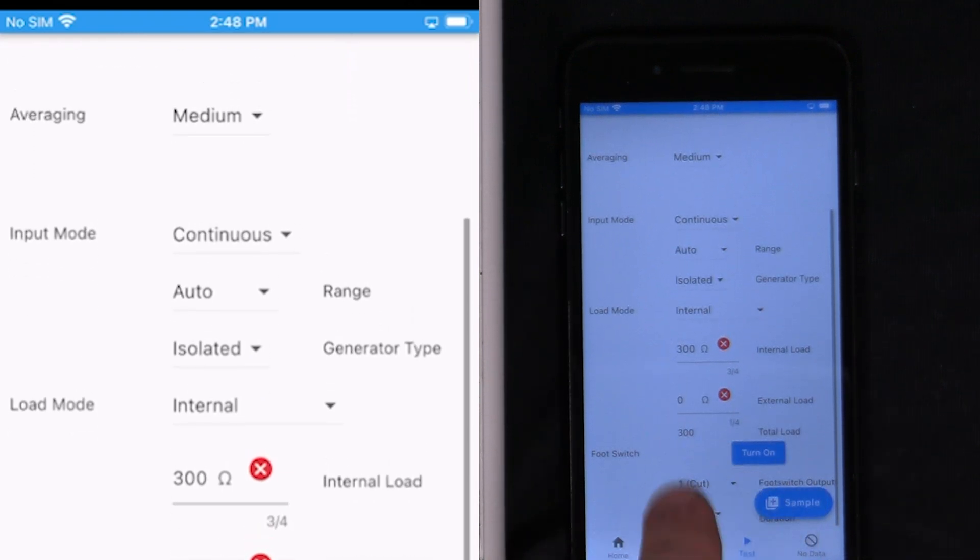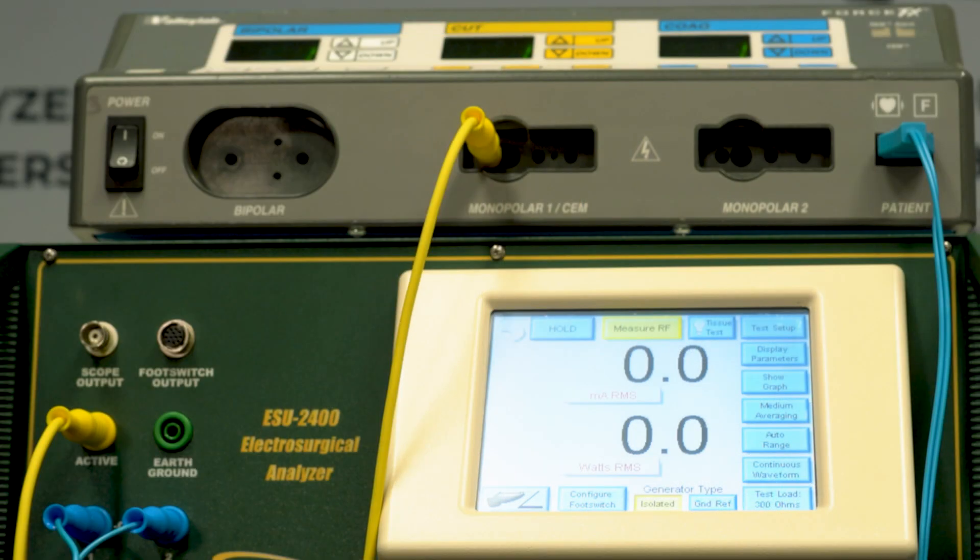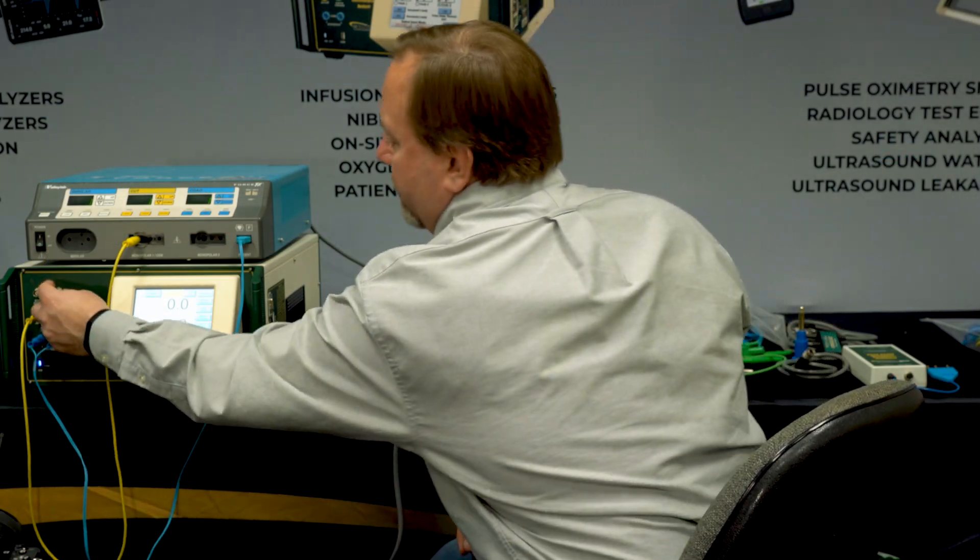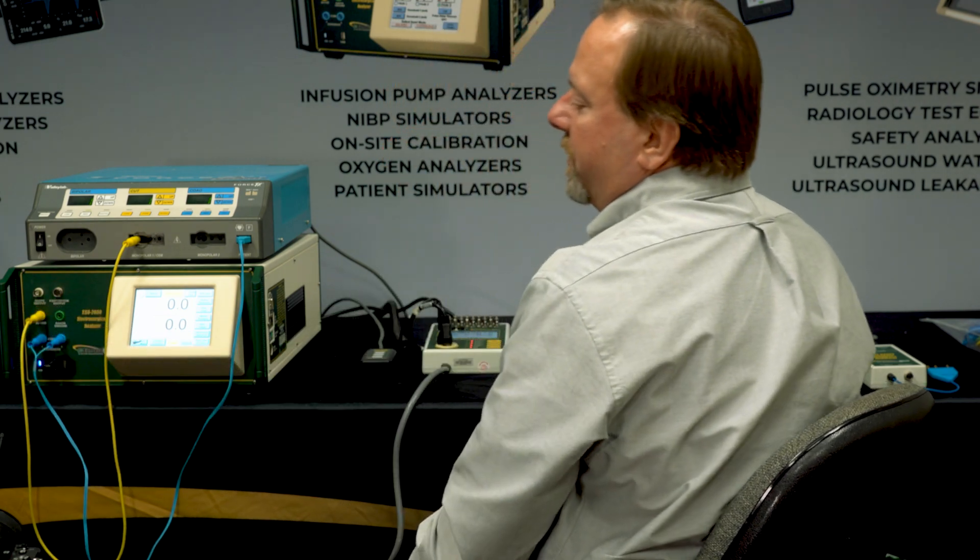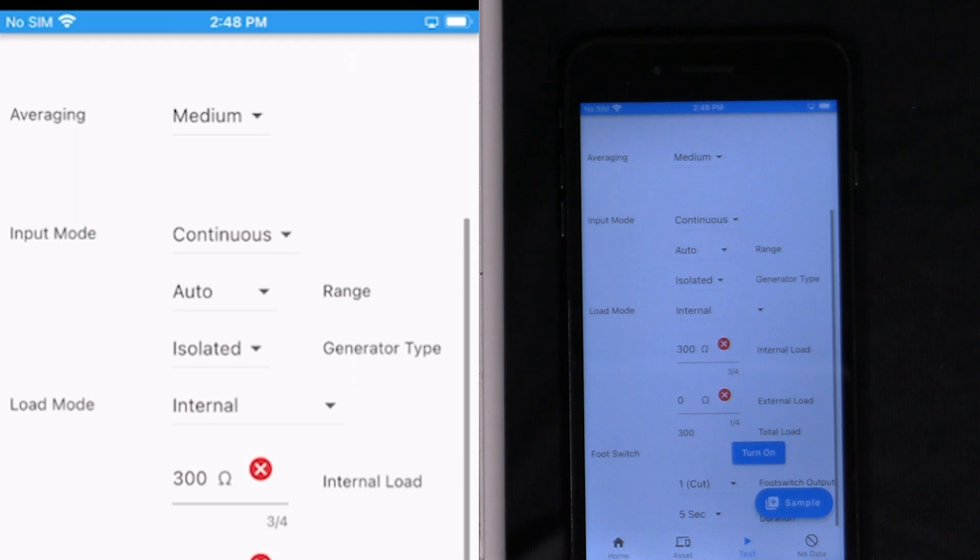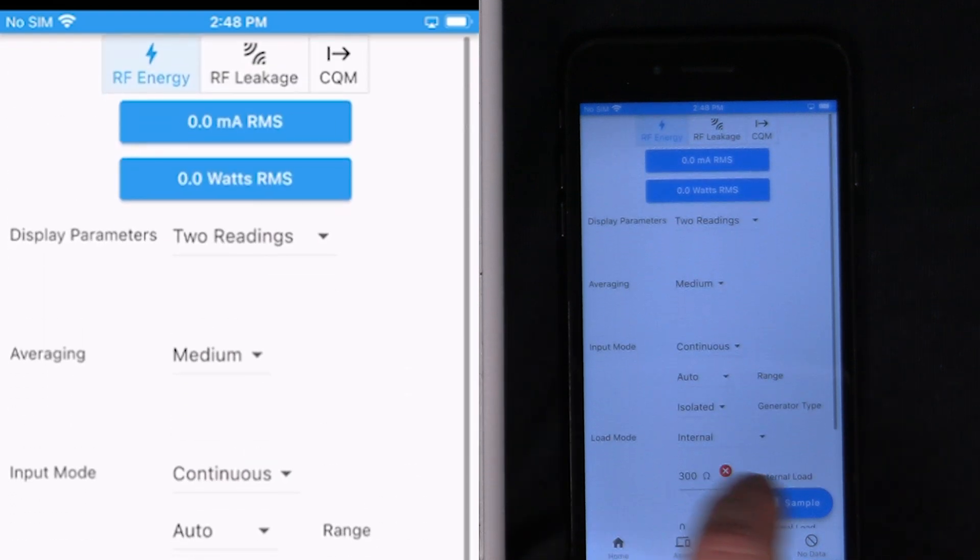We can activate the foot switch directly from the MyBC Mobile app. That's just like pressing the foot switch trigger here. That would require me to have one of the foot switch cables plugged into the foot switch output of the 2400 to trigger the generator. But we have the foot switch simulator plugged into the generator. So all I have to do is press these buttons on that simulator. Now we've got measurements shown on the screen for milliamps and watts.